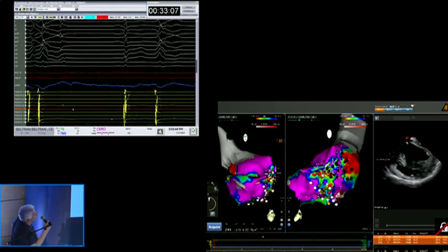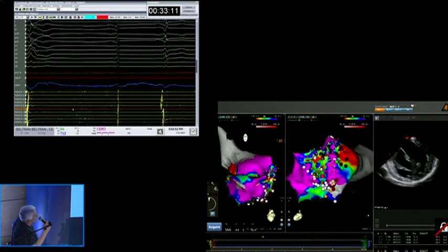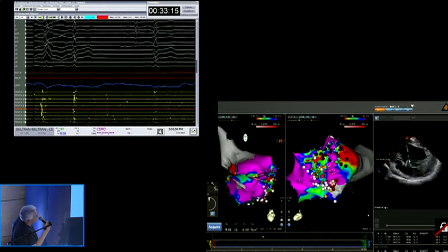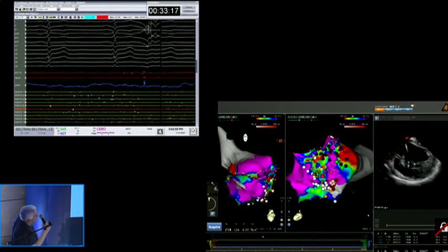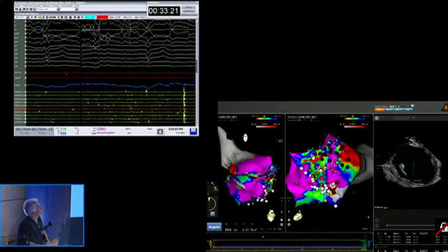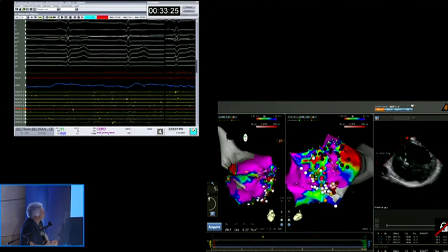Levántalo para arriba, el mapa ese, sí, más para arriba, más para arriba, más para arriba. Gracias. Voy a mapear un poquito esta zona. Un momentito que oriente el catéter. Y me vengo por acá.